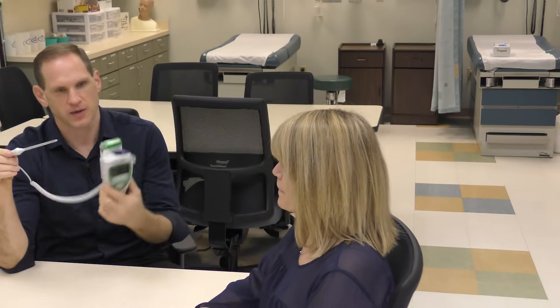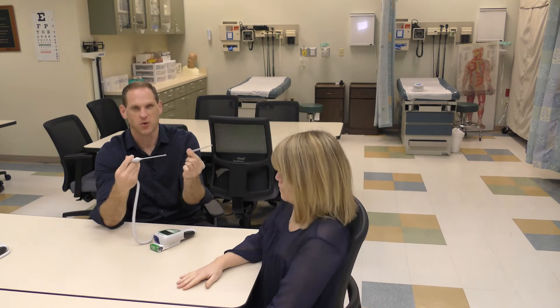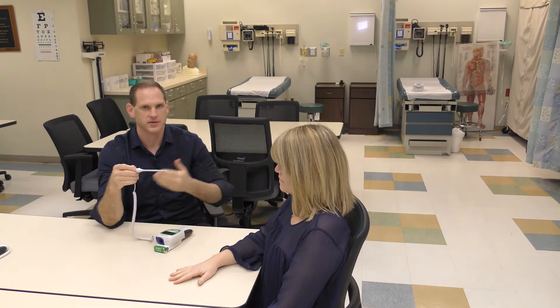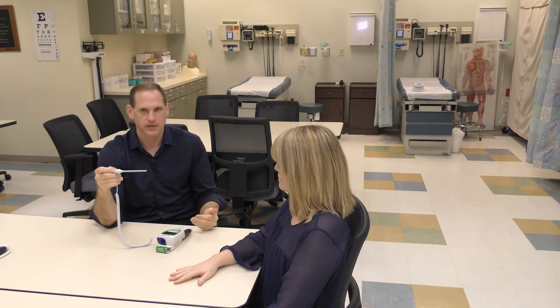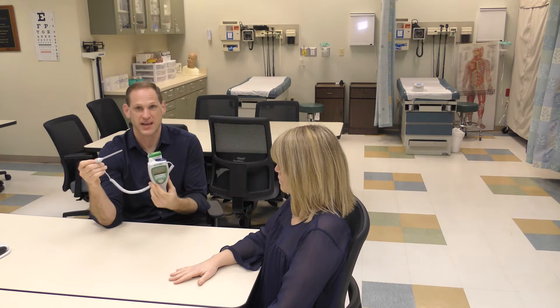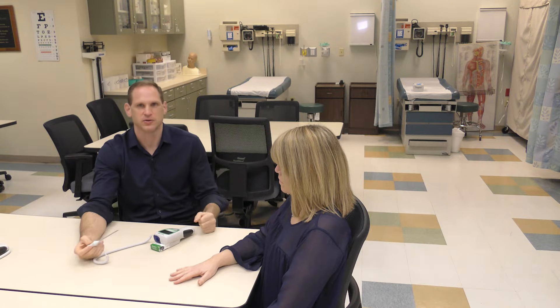Once you get a reading, push the button to eject the probe cover — it can sometimes fly, so hold it from the end. If the patient can't use an oral thermometer and you're not going to do a rectal temperature, you can use an axillary reading. There is a setting on the thermometer to indicate it's an axillary reading. When you document the temperature, make sure to document the route used. Also make sure your patient hasn't had anything to eat or drink within the last 30 minutes, as hot or cold liquids can raise or lower the temperature reading.